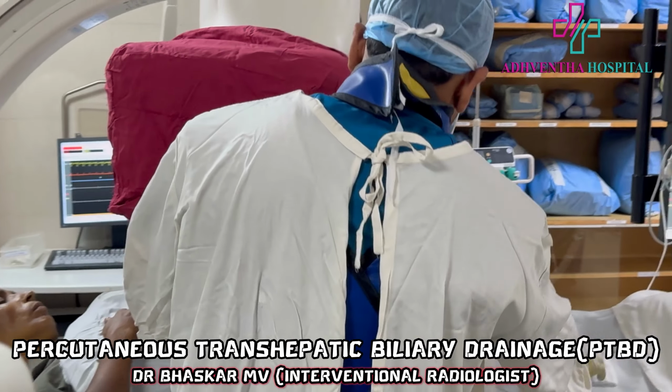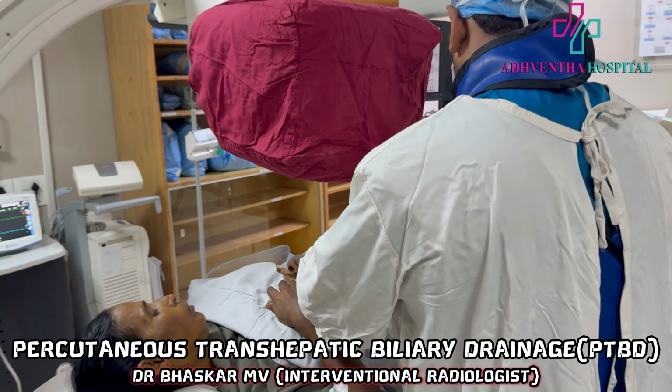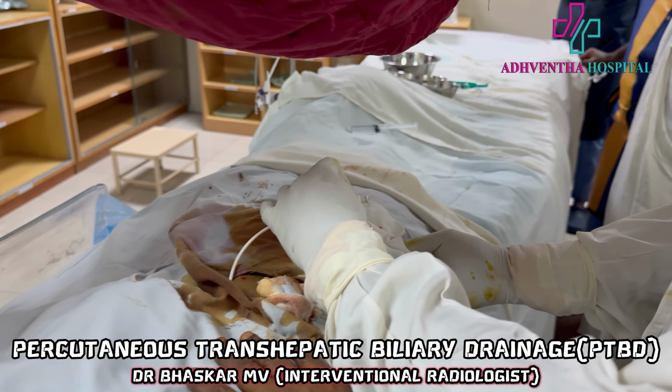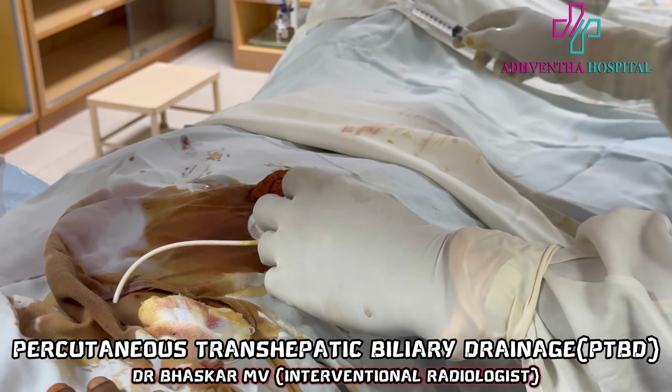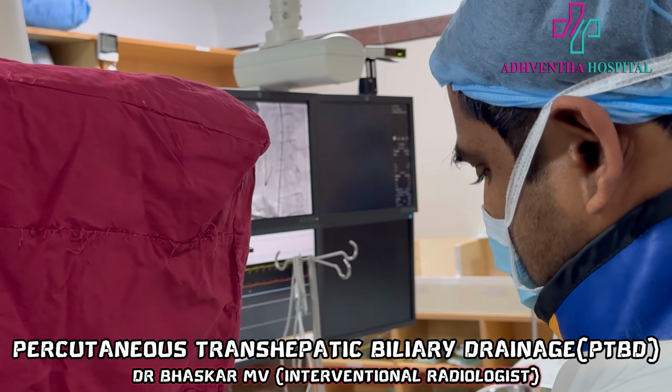You can see here honey colored flow. This is bile which is flowing outside. So whenever obstruction is there, that will happen. So now we will check by doing a cholangiogram what is happening there.